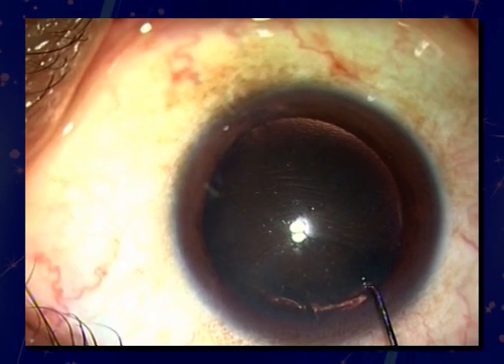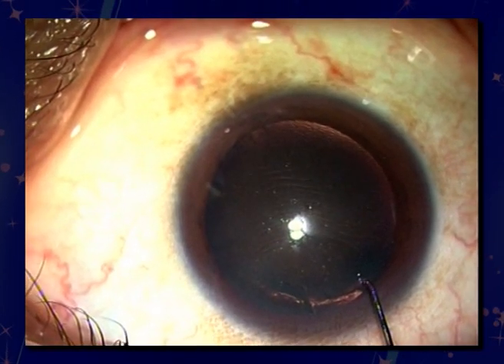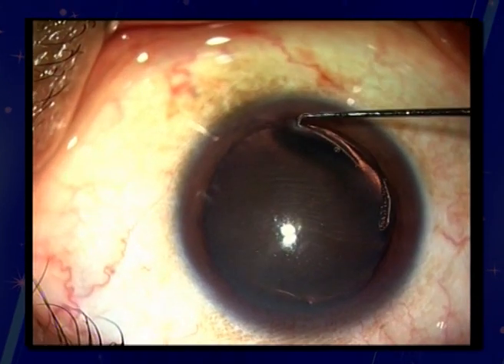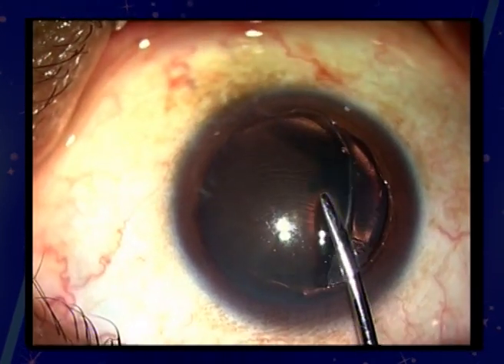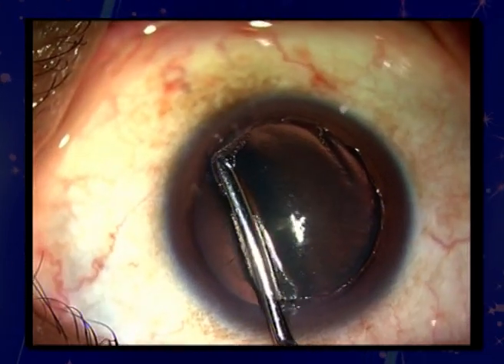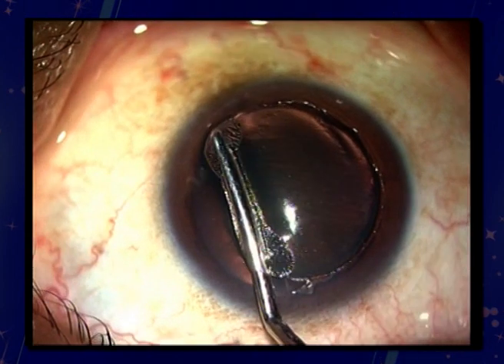In the first case, the pupil is dilated for a good transillumination effect on the striae. The flap margins are identified. The Sinskey hook is used to break the epithelium. The flap is lifted and floated on the bed.